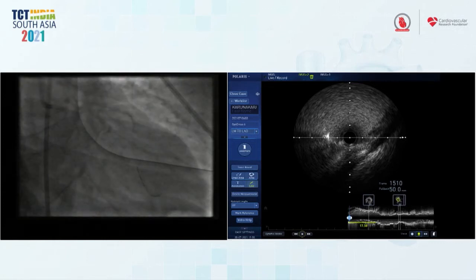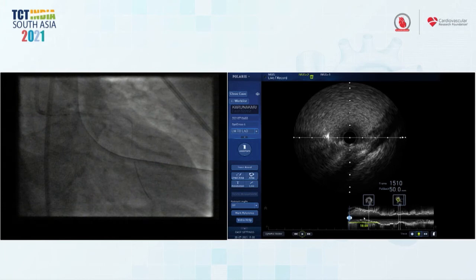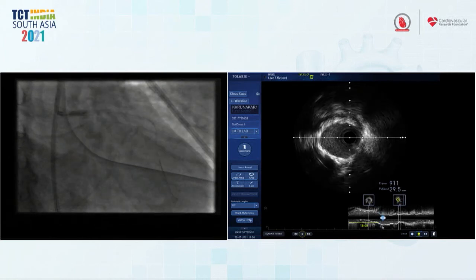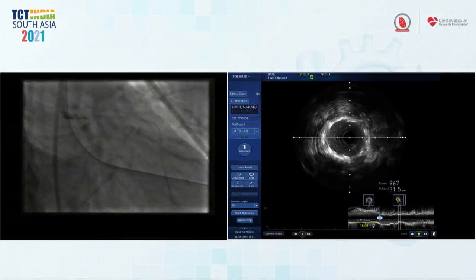I noted that you're very careful with your guide placement once the left main stent is out. So that's a very good technique, of course, for everybody in the audience. You really want to avoid getting sucked in with your balloons and then mangling the proximal edge of the stent, which increases your risk of target vessel failure by at least 2.5-fold. It happened in about 6% of the cases in EXCEL.